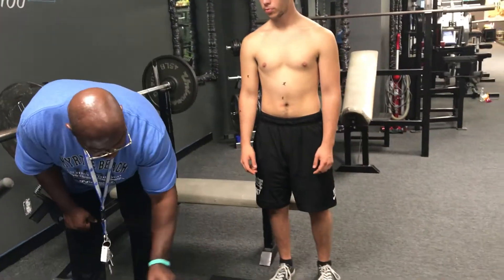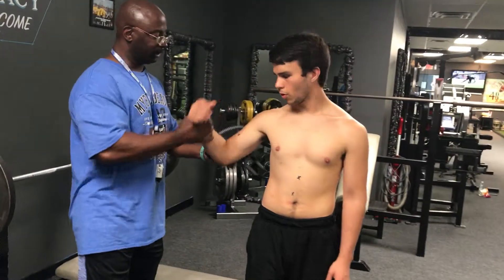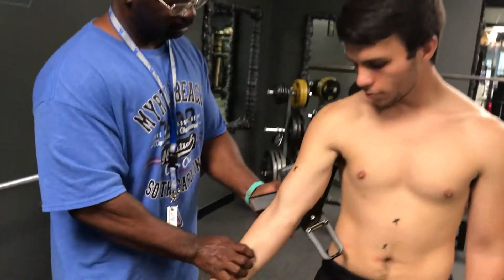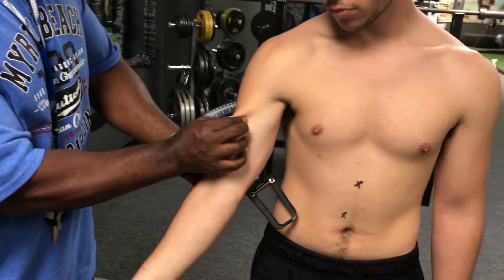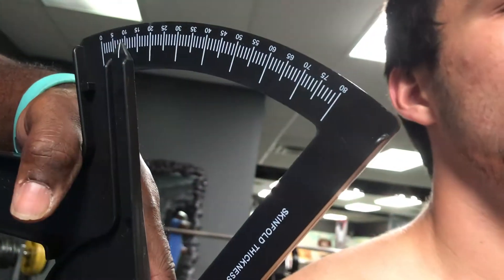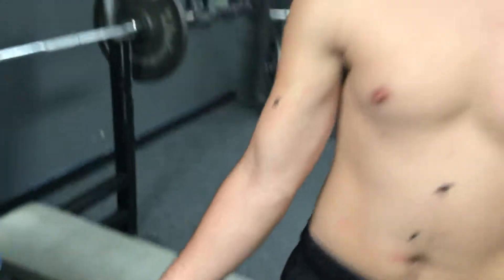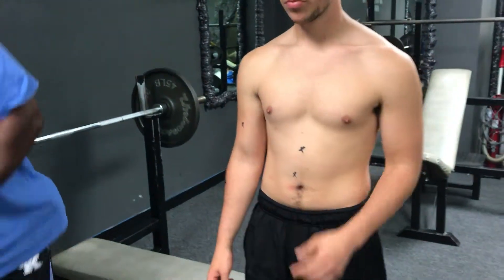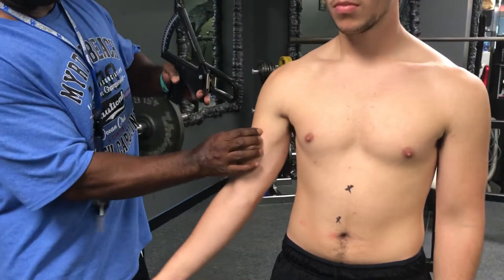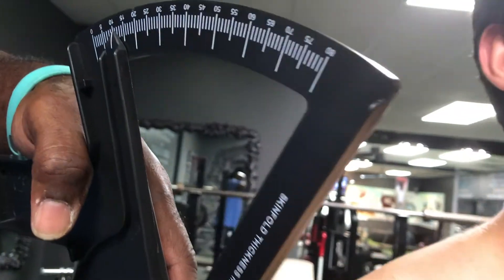Next is your bicep. I'm going to measure the belly of the bicep. Just hold it down like this. Right at 8. Excellent. Let's measure again to get a good average — and this one is 11.